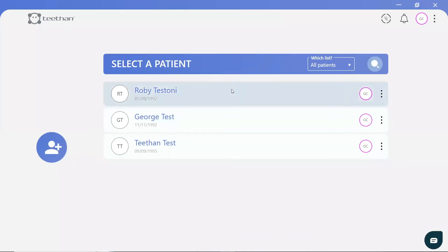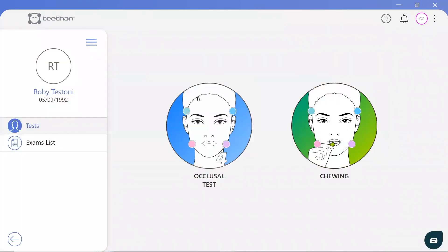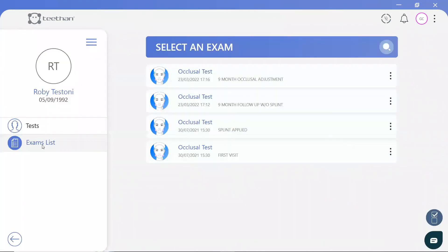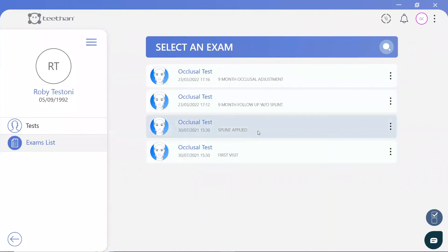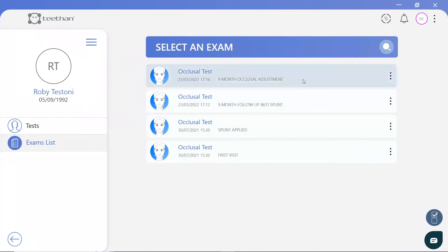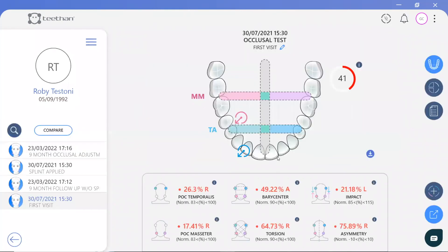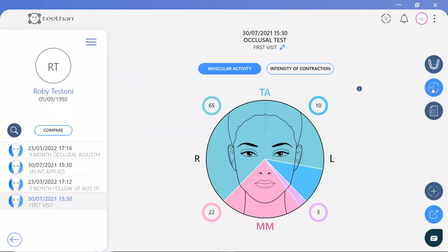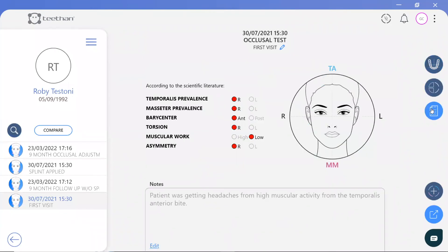Now we know how to quickly collect and analyse the data, let's look at a real-life Teethan case study to see how patient results can be accurately monitored over time. Here we have four Teethan examinations for a patient named Robbie, who was initially experiencing regular headaches. On the patient's first visit, we can see a low global index of 41% with a high prevalence of the right temporalis, leading to an anterior bite, right-sided torsion of the jaw and low impact. These findings are automatically highlighted for the practice and based on scientific literature.